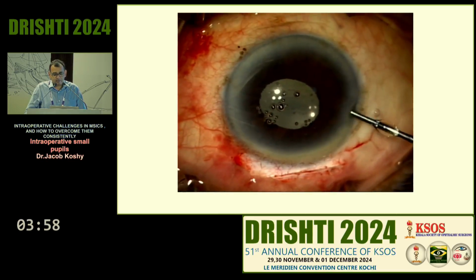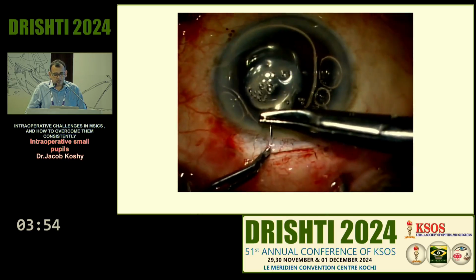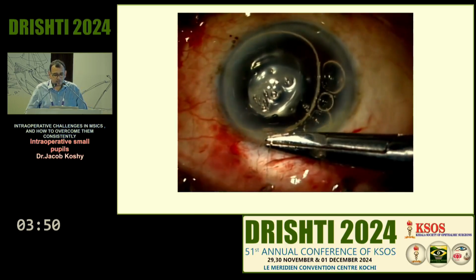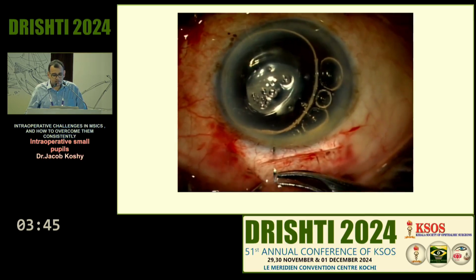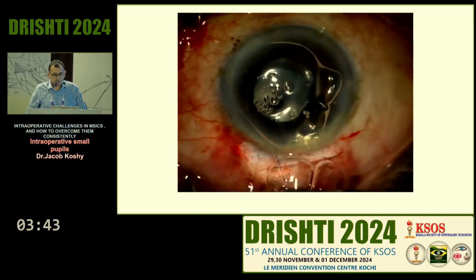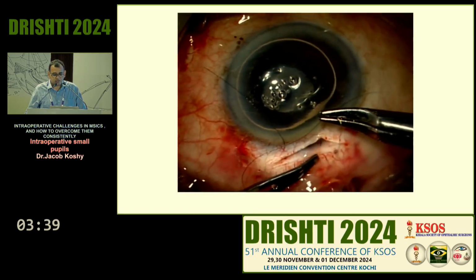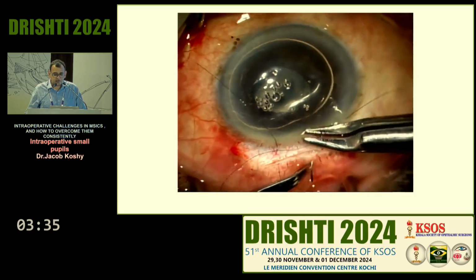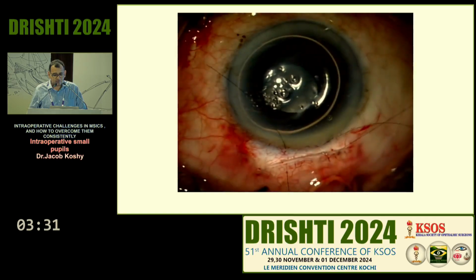Cleaning it up. Any patient you've done a vitrectomy, please remember to put in a suture. The last thing you want after all this is to try and go back because you have a leaky wound or a soft eye the first post-op day. So generally what I would do is I put a single cross suture for these cases. You can put a Fine's infinity suture if you know how to do that or you're comfortable with that. I usually put this cross suture.